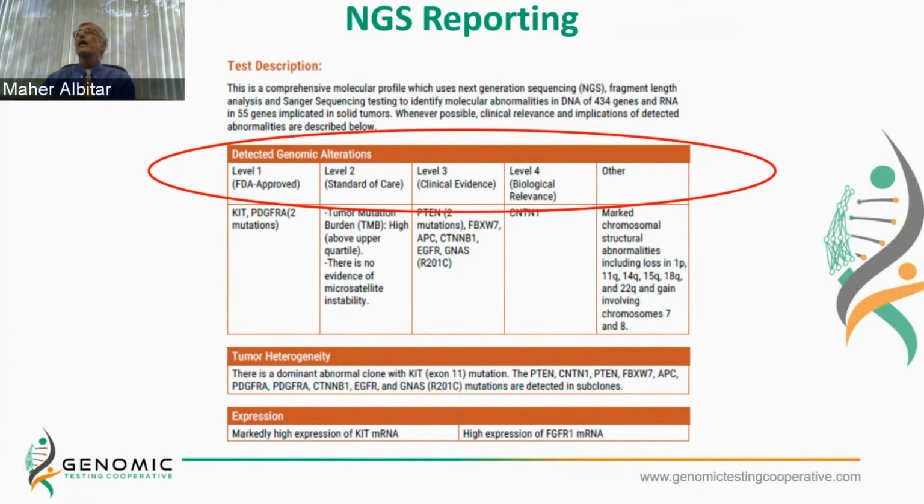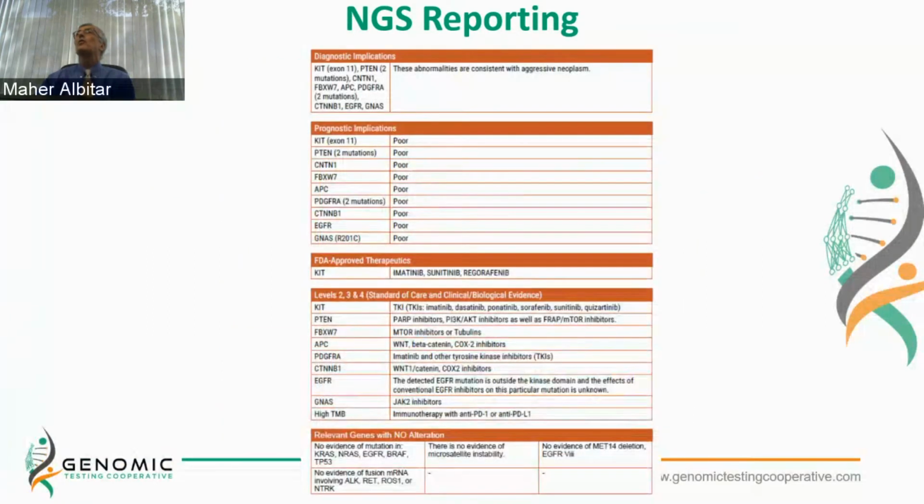Next slide. The report will also include the diagnostic implications and prognostic implications. FDA drugs will be listed, or drugs also related, or recommendations for drugs related to different levels of evidence. Next slide, please.